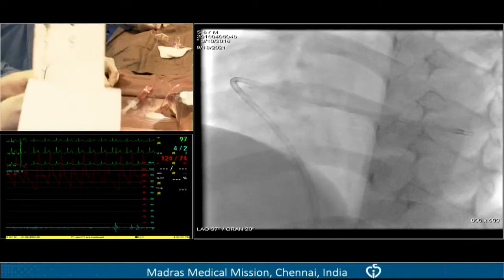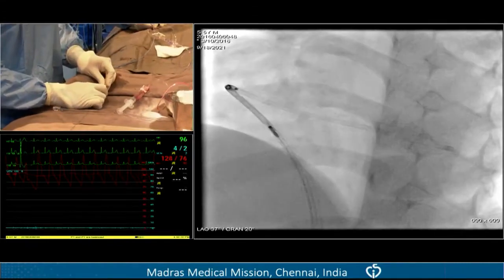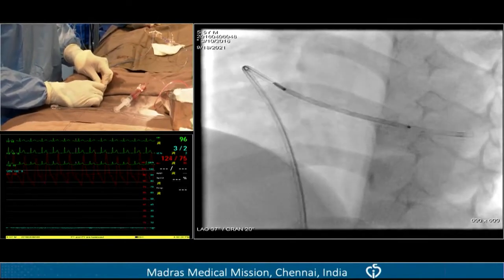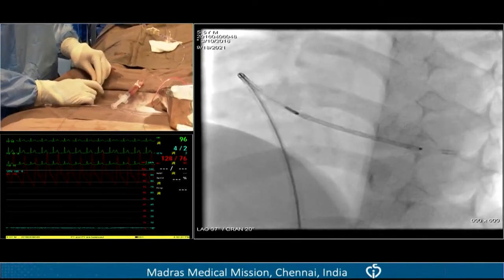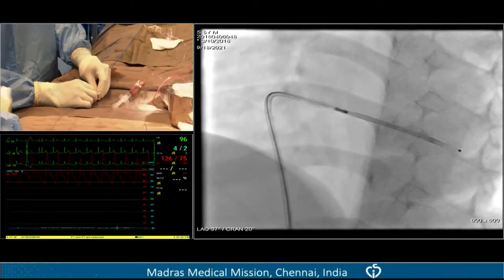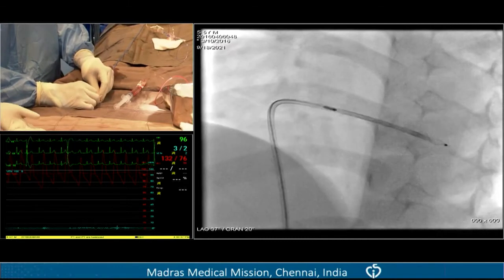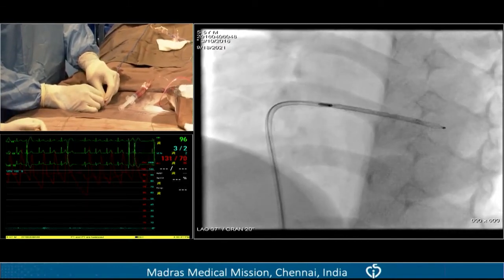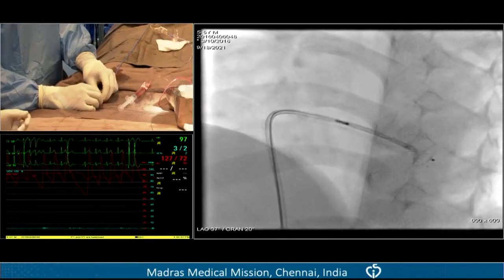He has taken it out. Just, Neil will not allow that. Shiva, just be conscious of the tip of your delivery catheter in the papillary muscle, in the myocardium, because those catheters are quite stiff. Yeah, I have those pulled out. I have come freely inside.